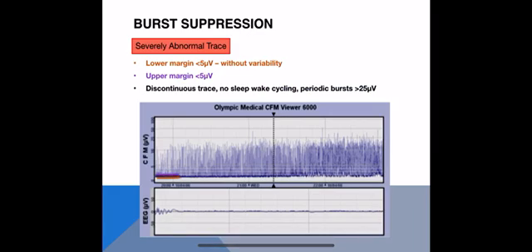This is a severely abnormal trace referred to as burst suppression. Both the upper and lower margins are less than 5. You can see a darker band of blue along the bottom showing suppression of the trace, and then bursts which reach up to about 25 microvolts in places — giving a burst suppression pattern. On the raw EEG at the bottom you can also see there is not much activity.